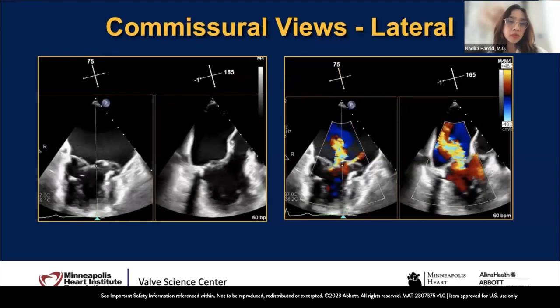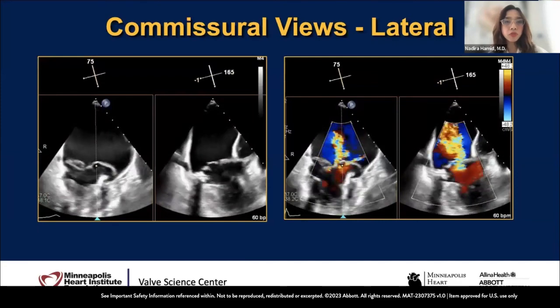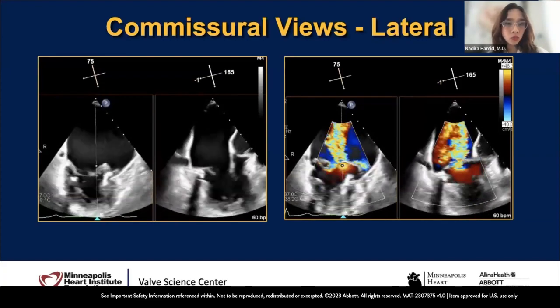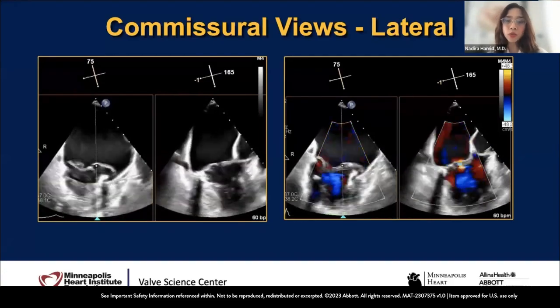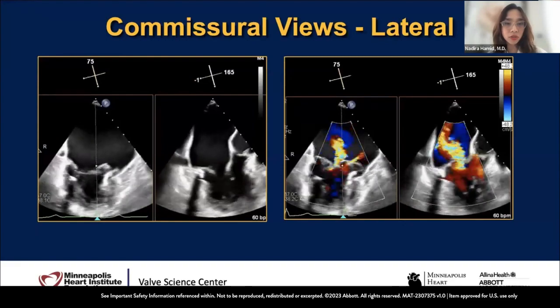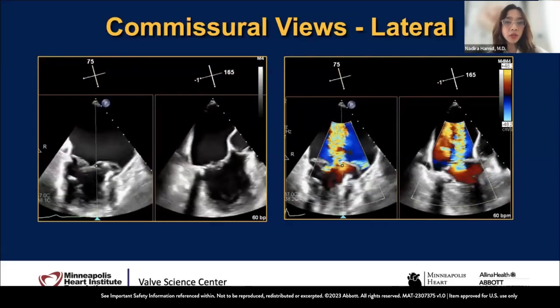When you do biplane imaging, you can look at the orthogonal view, the long axis view equivalent. You can see on the left-hand side, my commissural view is not exactly 60, but in between 60 to 80. So you have to adjust your degrees as you go forward and determine what is the true commissural view. Because patients lying on the side doing pre-screening or on the table, right, Ryan, it varies accordingly. And depending on anatomy of the heart, being a horizontal heart, depending on their spine as well. And so commissural views with biplane imaging, I think is so key.